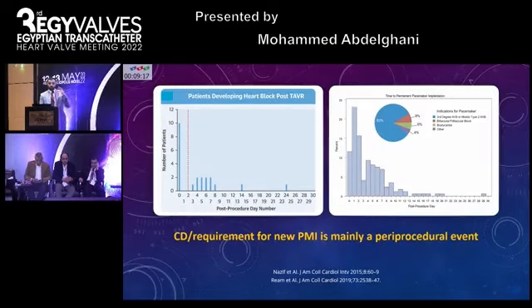We need to bear in mind that the vast majority of these conduction disturbances arise very early during the procedure or in the few hours thereafter. Of course, some other events may occur over the next few days, but the rate is much lower than in the earlier phase.